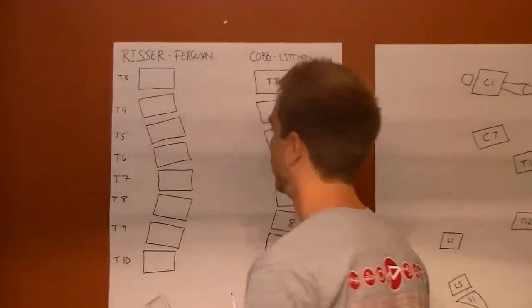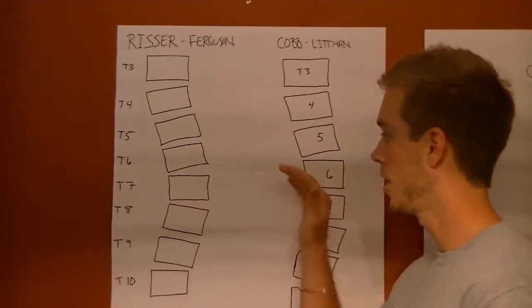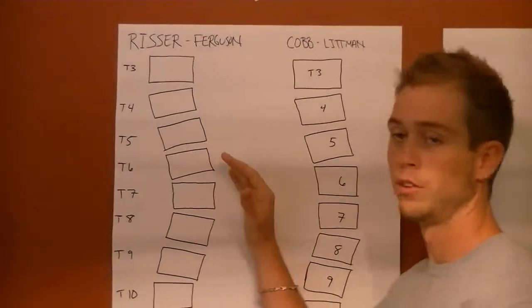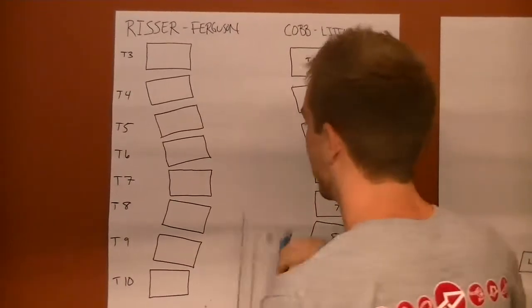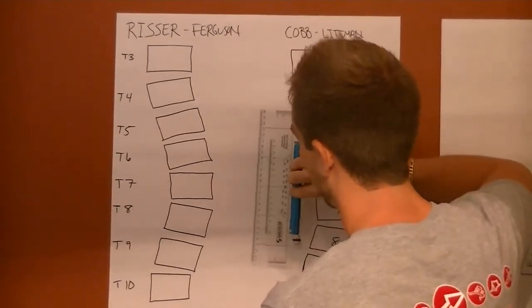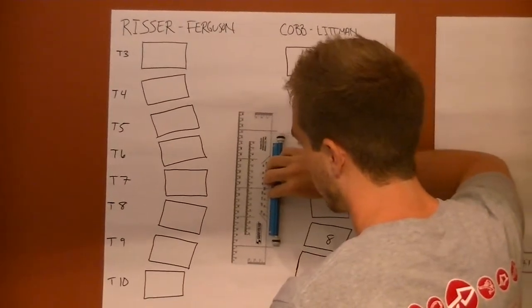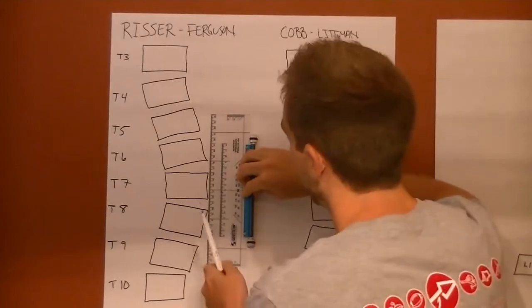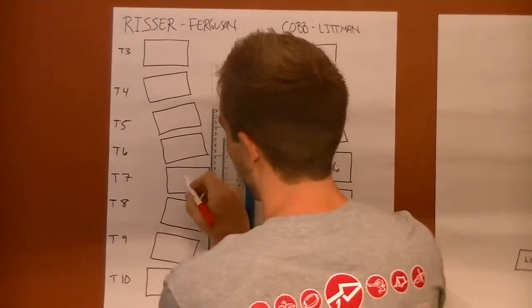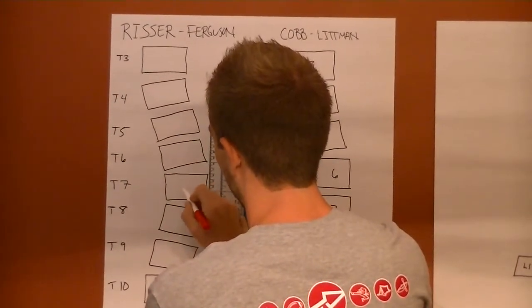What you want to do is find out where the scoliosis has protruded the most, where it's sticking out the most, and that's going to be considered your apex. So you take your rolling ruler and move in until the first vertebra hits. Right here that's going to be T7, so we'll mark T7 here.